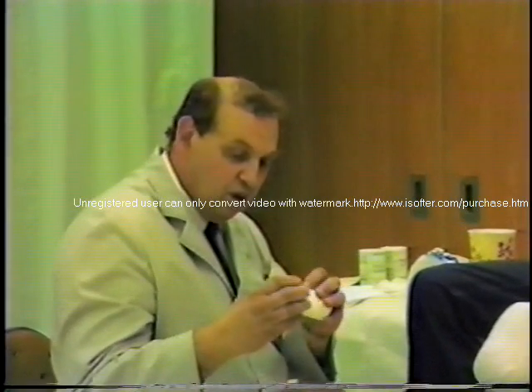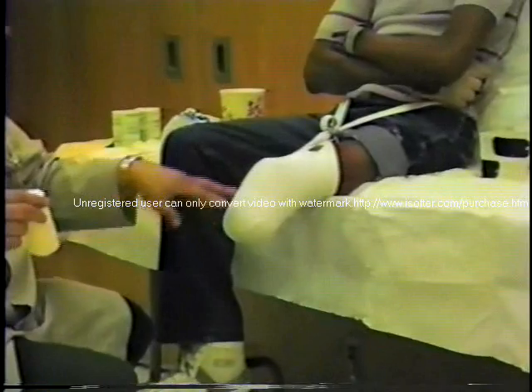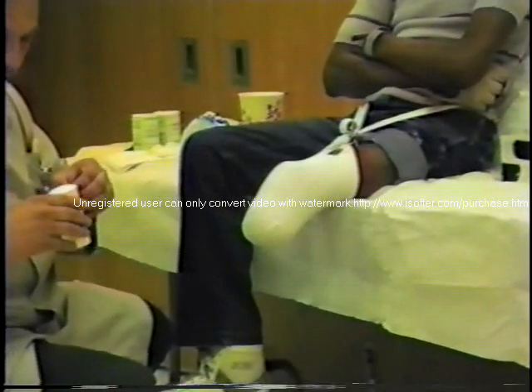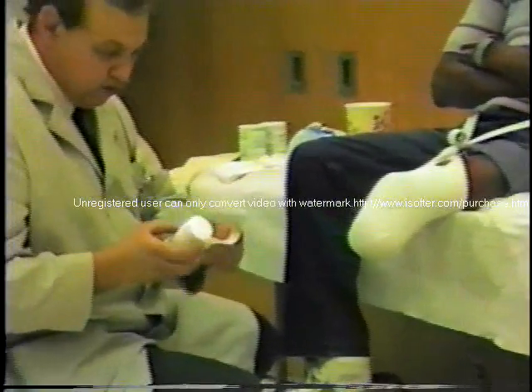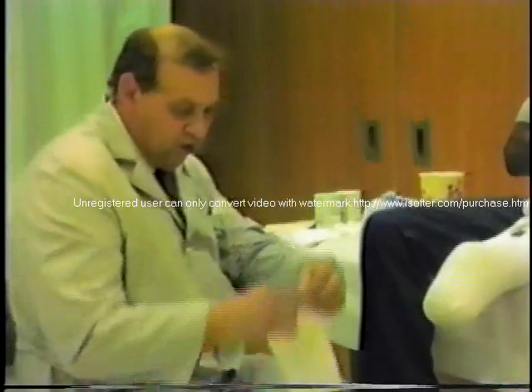Now remember, this is going to be primarily for reliefs and will later on be removed and discarded so that we have graded relief over the bony areas. Now ideally, 6 inch cast padding is preferred because you don't have to do quite so much tearing.